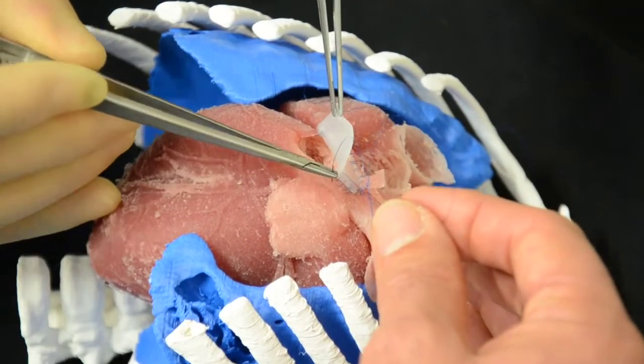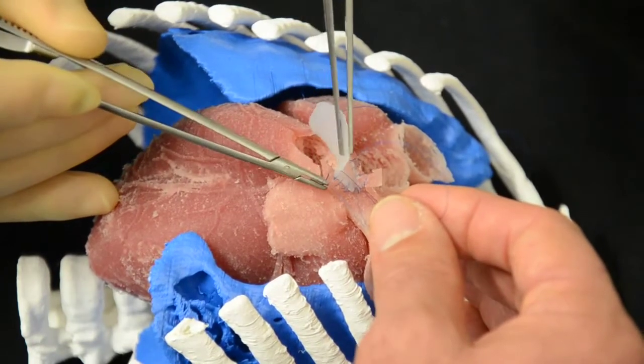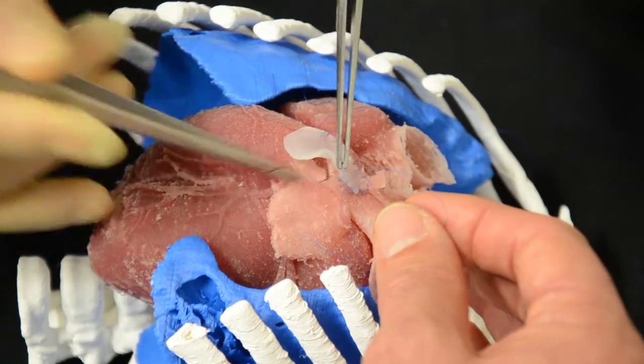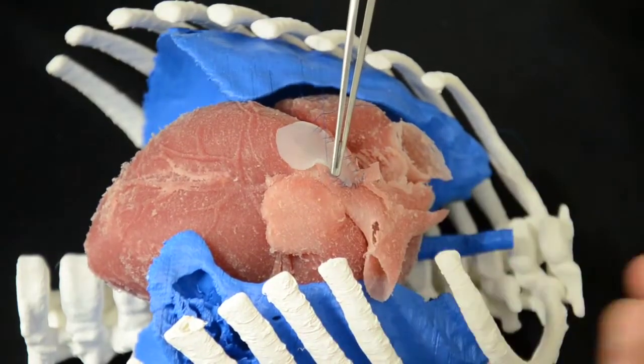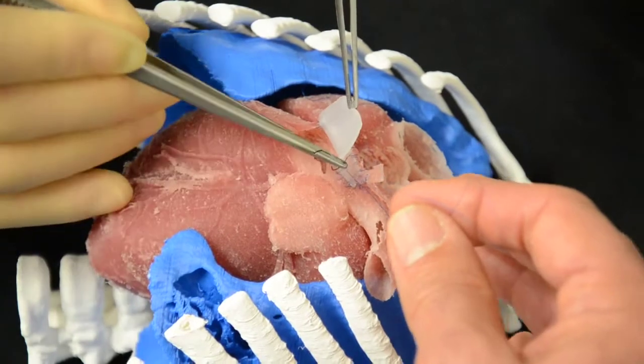For heart operations, before you get to this stage we need to connect the baby or patient to the heart-lung machine, which is a procedure in its own right — essentially connecting tubes or cannulas in different parts of the heart.